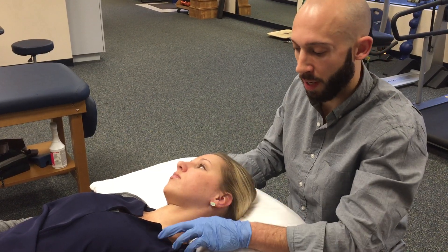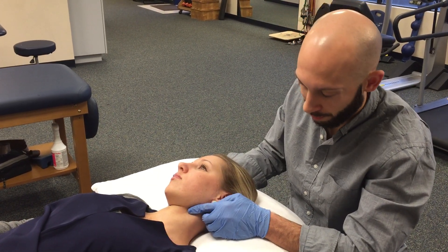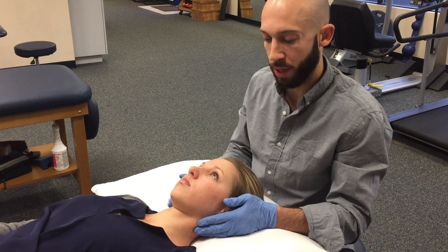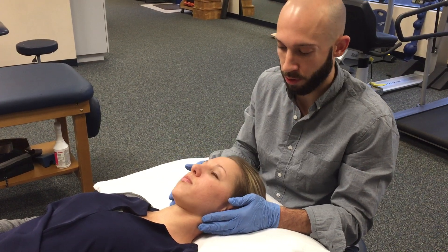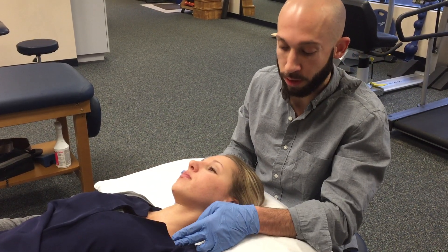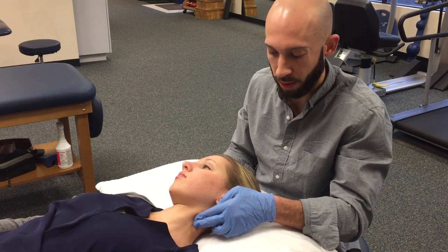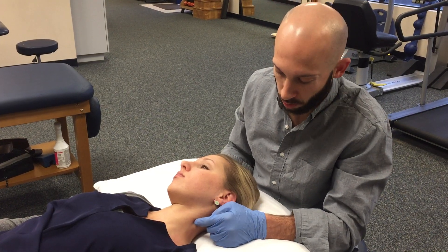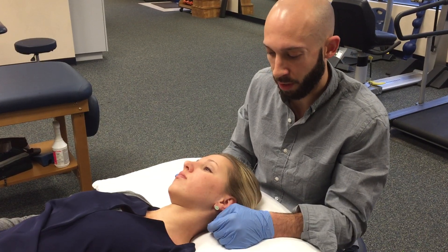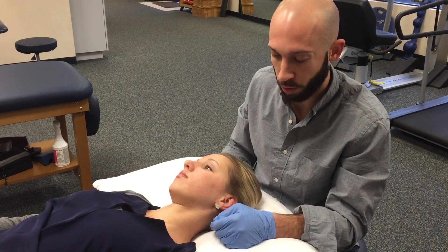Next we're going to look for the external jugular vein, which is going to be found laterally on the neck. If it's hard to identify, there are two techniques you can use. You can either have the patient take their fingers and blow between their fingers, and sometimes that will help the vein to stick out. Or you can come over it and do a gentle stroking motion to try to get it to pop out a little bit. With Laura here we can identify the vein to be right here. Those are two major landmarks we want to avoid while needling to prevent any bruising or hematoma.